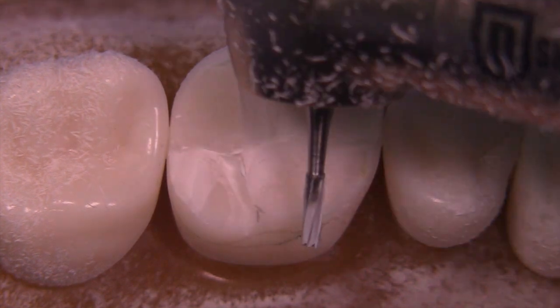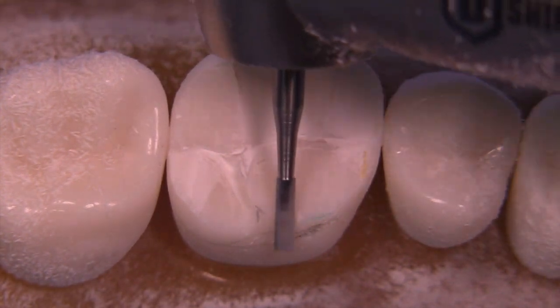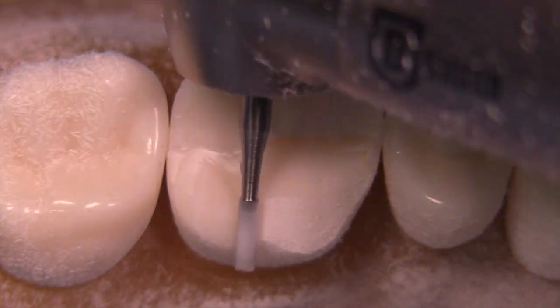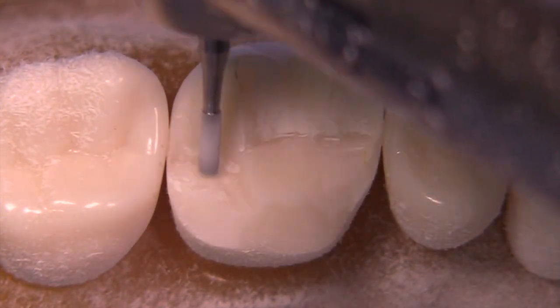We're now working on the A-plane, also known as the functional cusp bevel, and we'll utilize the burr once again by judging how deep it's going into the tooth — looking at the thickness of the burr to get the approximate reduction we need.